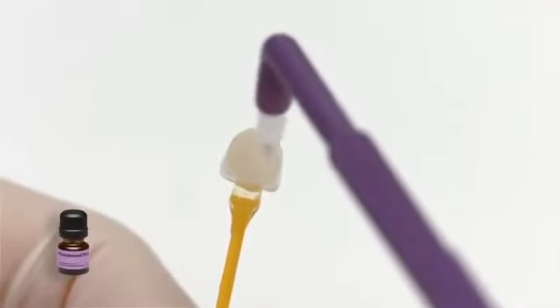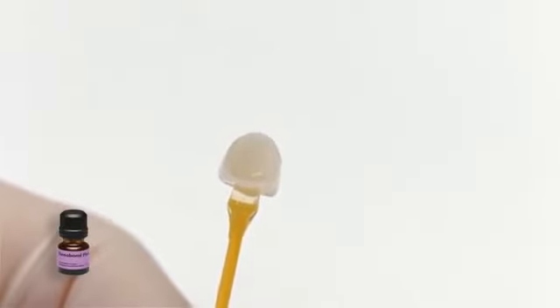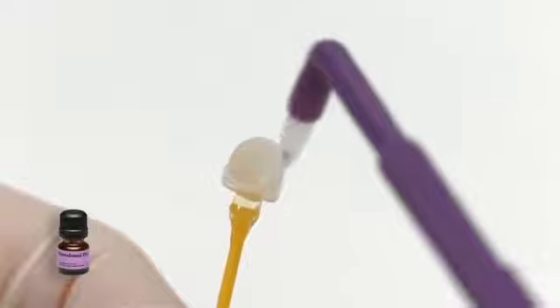Apply Monobond Plus bonding agent to the pre-treated surfaces with a brush or microbrush and allow it to react for 60 seconds. Disperse any excess with a strong stream of air.